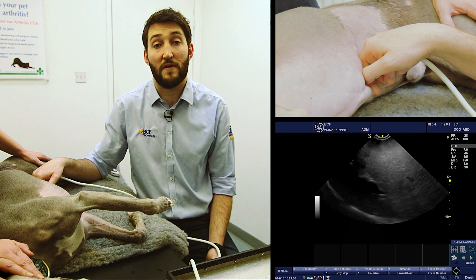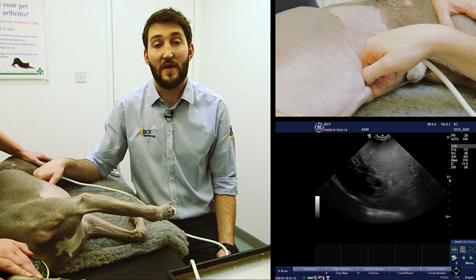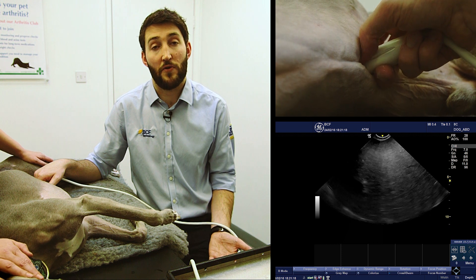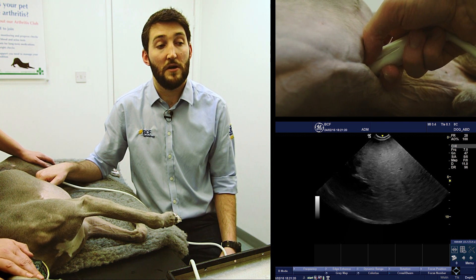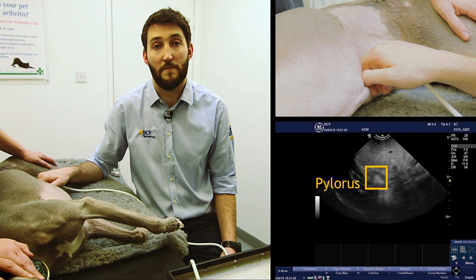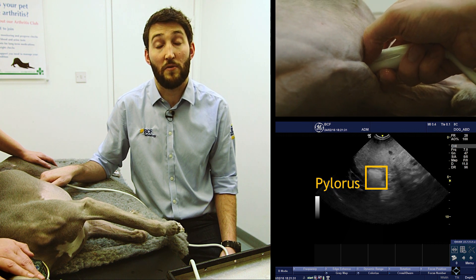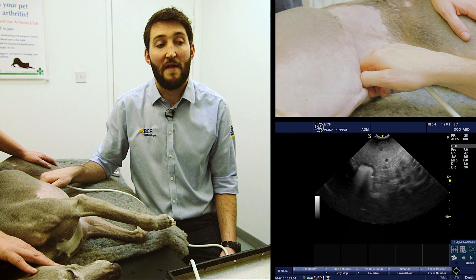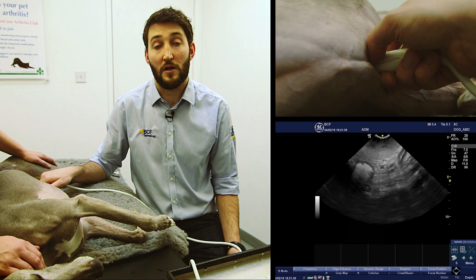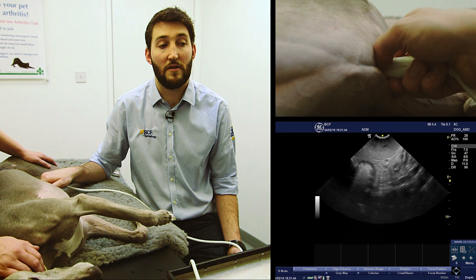Then we're going to fan to the dog's right — so down towards the table — until the stomach and specifically the pylorus have disappeared from the image. Once we've reached that point, we're going to very slowly fan back the way we came, away from the table towards the dog's left, until the pylorus comes into view. At that point, tilt the probe a little more cranially so the pylorus swings slightly to the left of the screen, then continue to fan up towards the dog's left, watching the bottom of the screen for the portal vein.